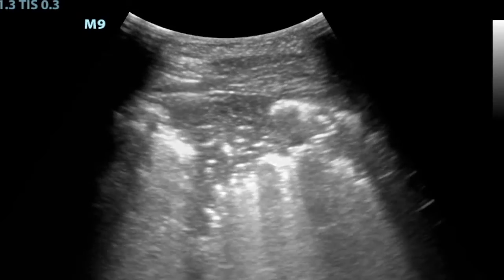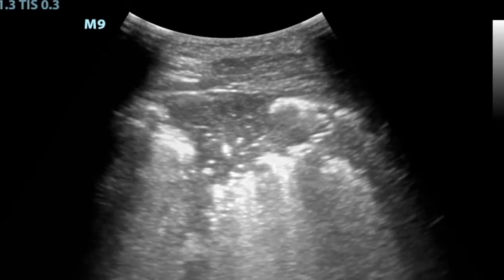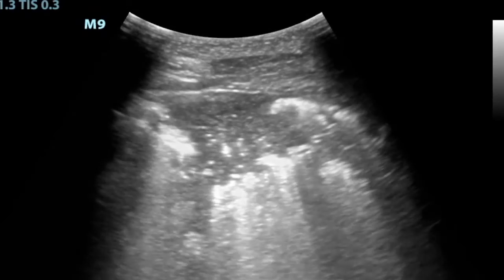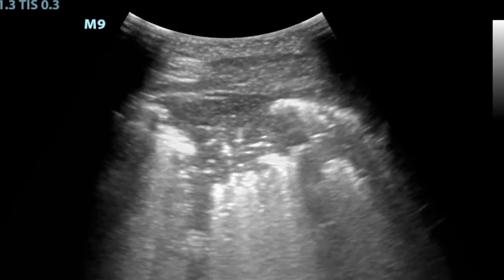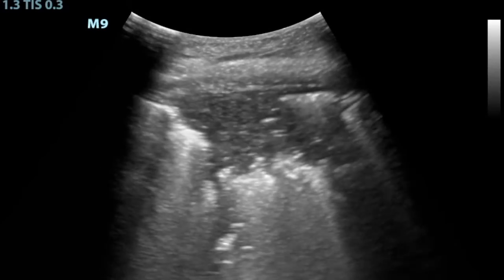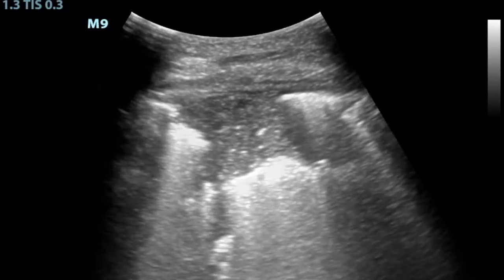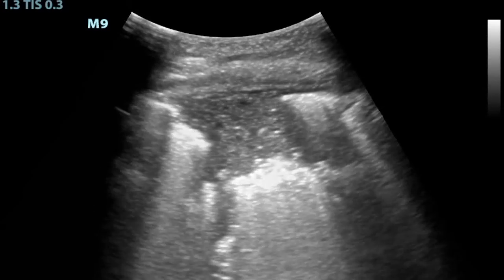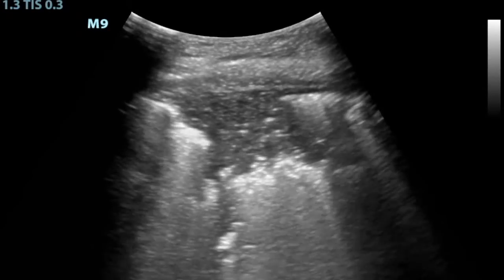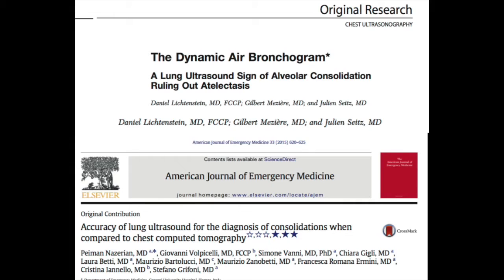Lung ultrasound has a 60% to 90% sensitivity for pneumonias, depending on the study that you read, but it has better than 95% specificity in pretty much every study. For more information or proof that anyone can do this, check out these two papers. Again, props to Kovar on a great scan.